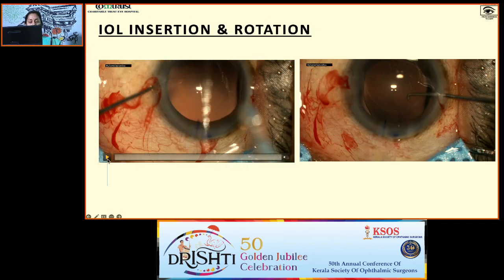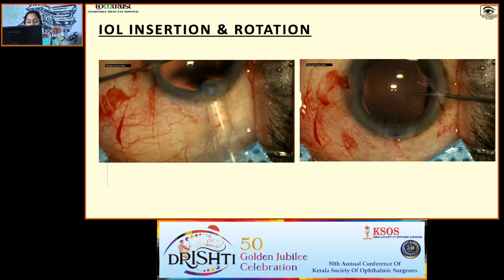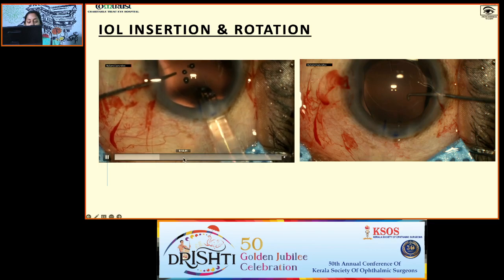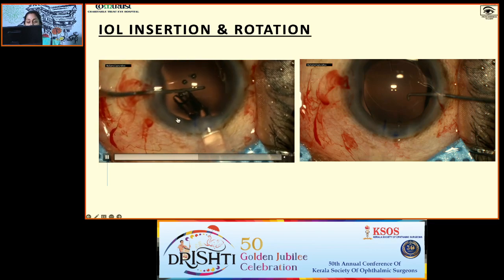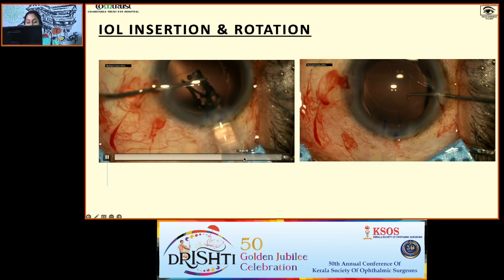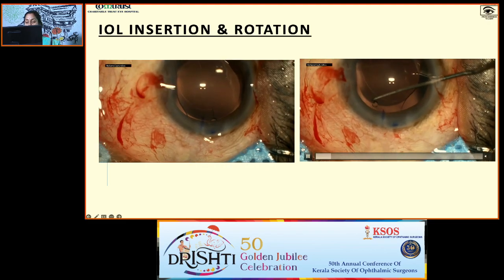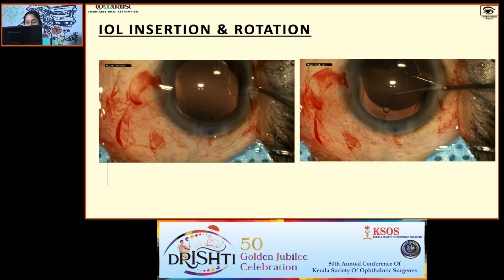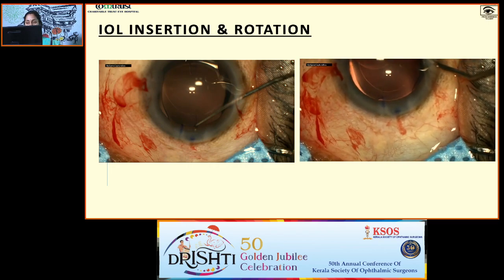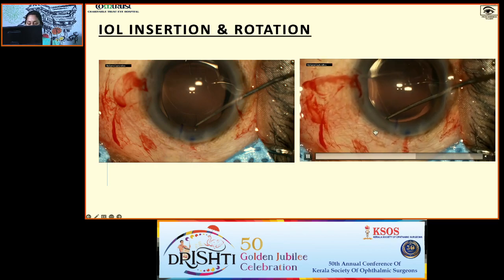This is a square plate IOL which is implanted. The leading end of the plate has to be placed inside the bag and the trailing end, let it be in the AC. And you can dial it from there to the needed axis, and once you reach the needed axis, just press it and keep it inside the bag. Once it is inside the bag, just see the IOL marking is in alignment with your corneal marking.